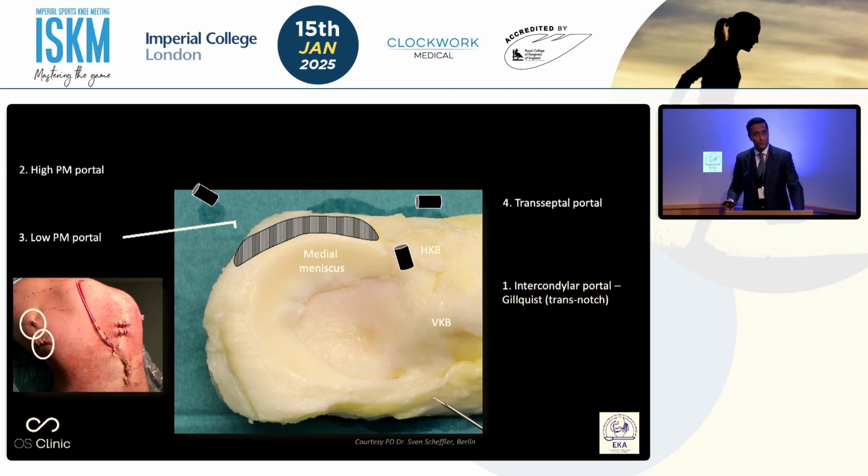We're getting better and better with our approaches on how to look through the knee joint. The transeptal approach was not something that I got taught during my training, and I still think it's not something we routinely do. But if you want to have a really good look at the back of the knee, whether you're doing PCL surgery, like Rahul was talking about earlier, or ramp repairs, this can be a really nice way of looking at the back of the knee.